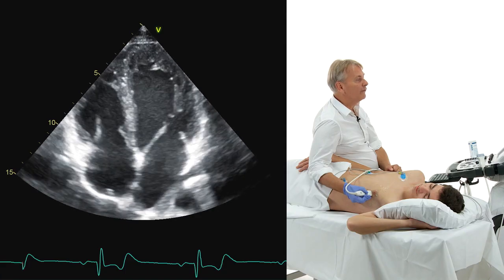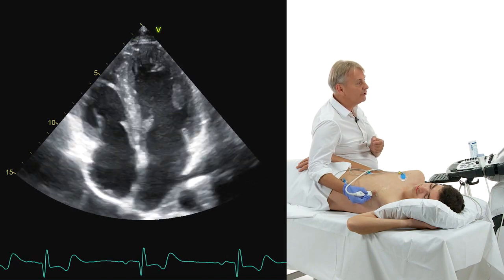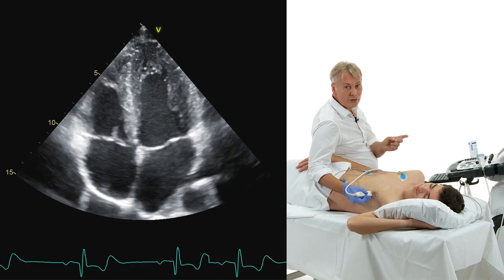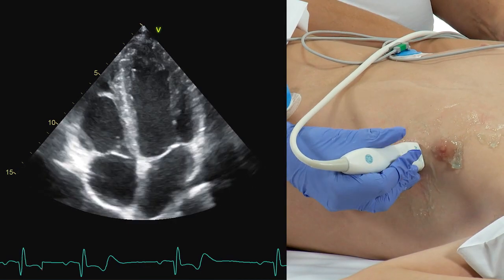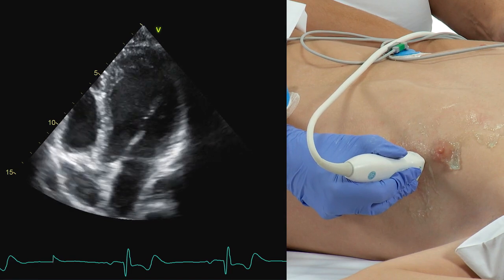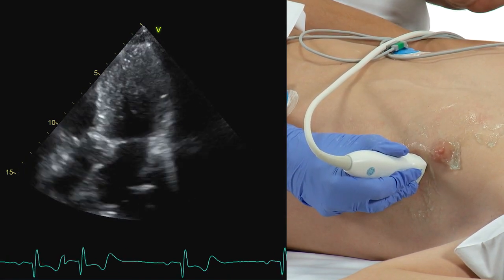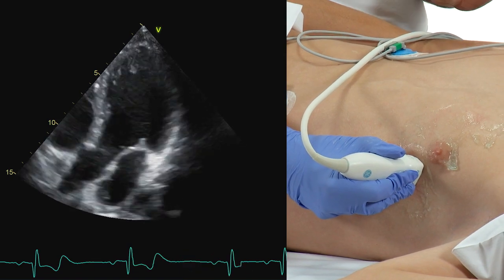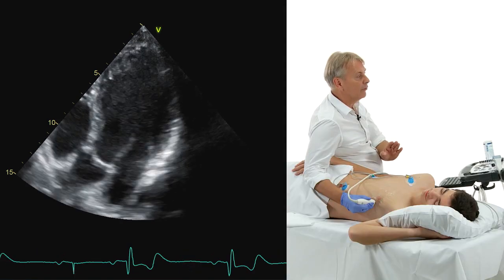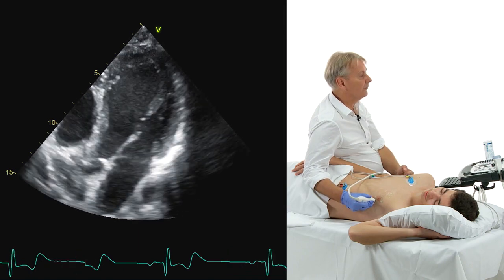Well, you start from a four-chamber view, and then instead of rotating towards the two-chamber view, namely counterclockwise, you rotate clockwise. Now see what happens. All of a sudden, you will get the aortic valve in your field of view. Now this is not a classic five-chamber view. I'm not tilting, I'm just rotating. And by rotating, I also have the aortic valve in my field of view.